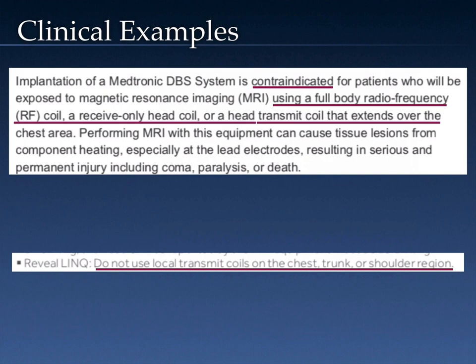Now, statements like this are sometimes confusing because the types of coils that are mentioned here do not exist in product form. Nevertheless, it's important that all technologists and radiographers know what types of coils are available and utilized on their MR systems.